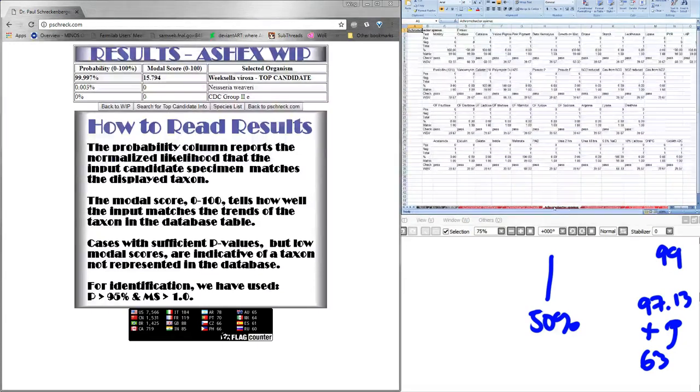Achromobacter spanius, for example, has also been oxidase positive 100% of the time. So once again, that organism would be represented in the standard matrix by 99. However, there's only been one occurrence of that bacteria species during the entire time of our data collection. So instead of 97.13 here in the Wilson binomial, or 99 in the standard matrix, this is 60.33. So this is a great tool if you happen to have a result that looks a little bit off.